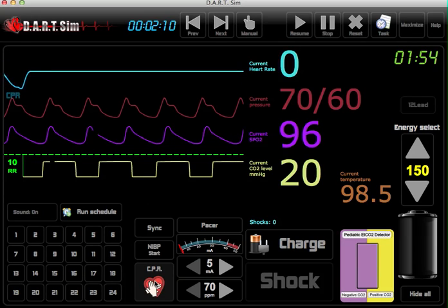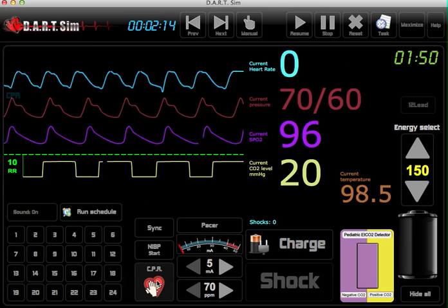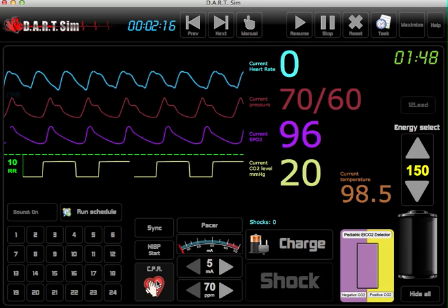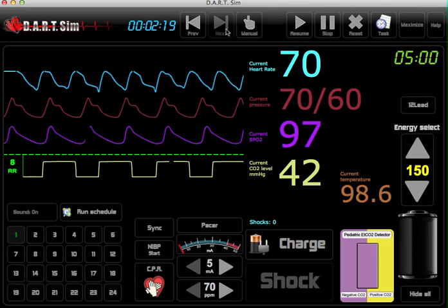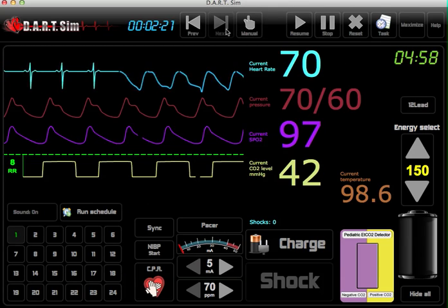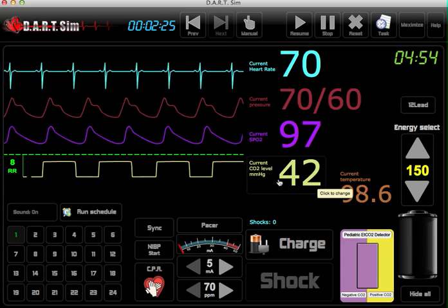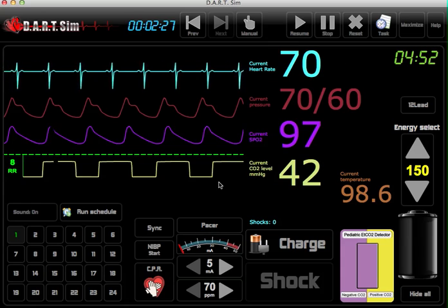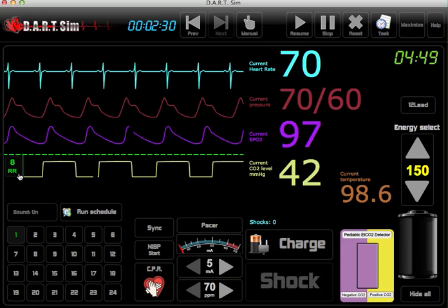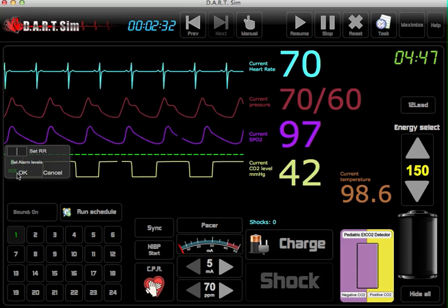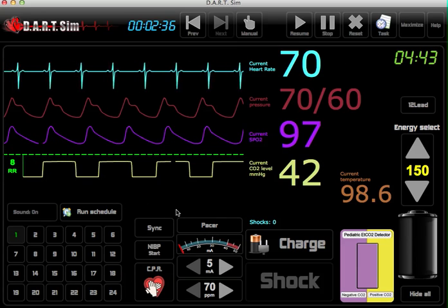We can resume compressions, and then advance to the next scenario. We've got a spike in CO2 — we check our pulse and the patient does have a pulse, but no breathing. So we can monitor the respiratory rate here. Patient is intubated. We can also adjust the rate here manually or by holding the R key.